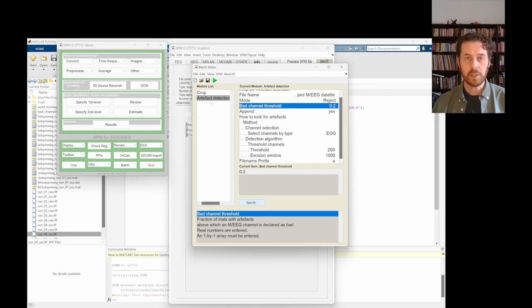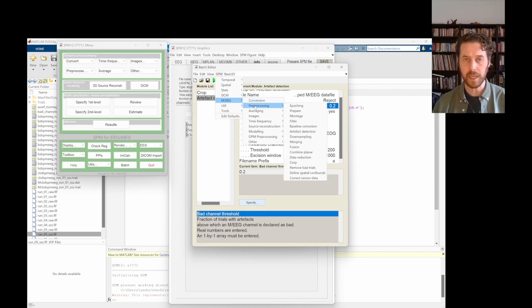The next thing we're going to do is deal with something specific to this MEG data set. We've got these planar gradiometers, and what we want to do is reduce that data down to a single vector. So let me just load this up. The combined planar.